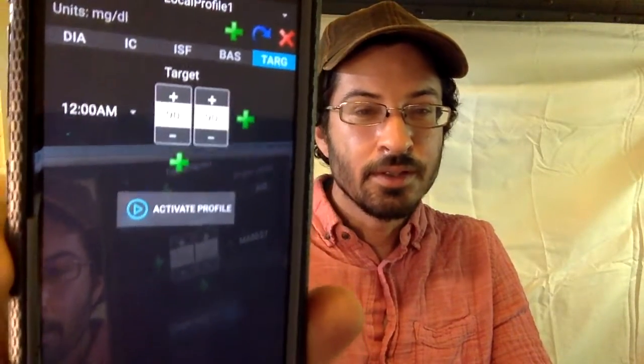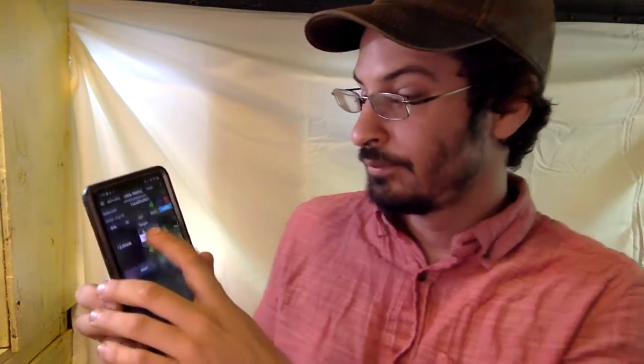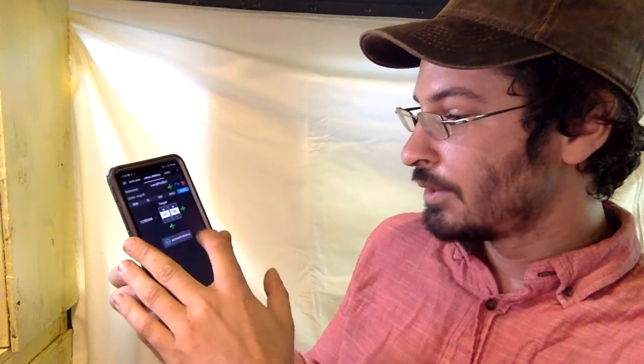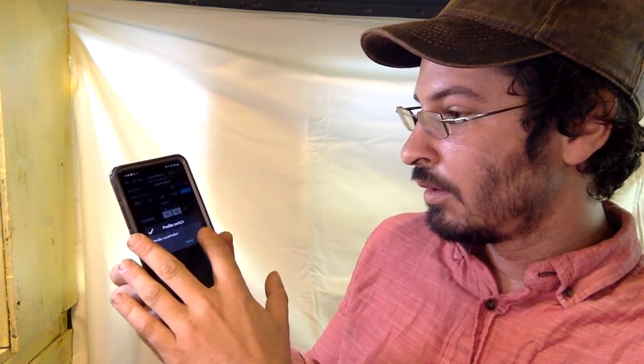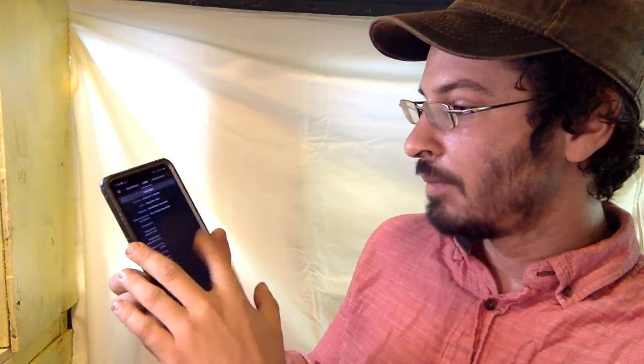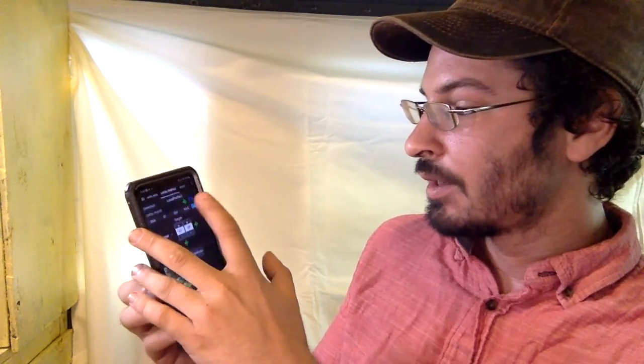And then your insulin to carb ratio, your IC, you want that really dialed in. And then your target, you can set your target. Mine's just 90 to 90, 24 hours. So I can go 87 to 90, and it will let me activate that. Let's see if it's changed. But maybe that was just in open loop. I've gotten errors when I tried to make my high number in the target below 90. We'll see if it lets me do that. So, yeah, play with those. That's the main thing you really want to do.